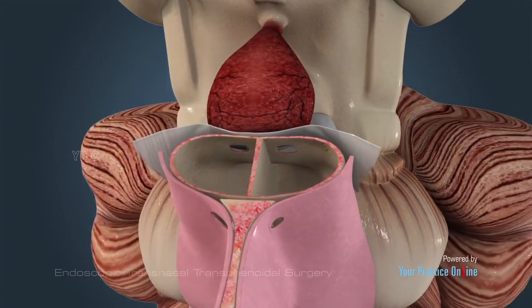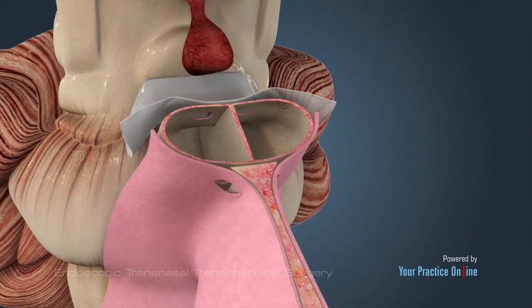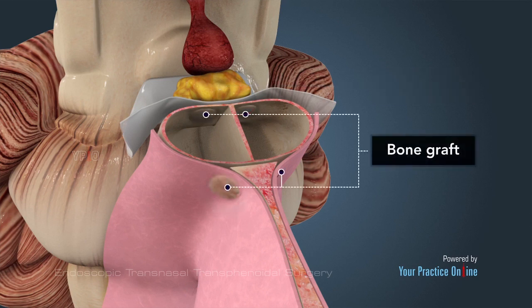Your surgeon uses special instruments called curettes through the other nostril to remove the tumor. At the conclusion of the procedure, your surgeon will usually take a fat graft from your abdomen, which is used to repair the opening into the skull base and to prevent any CSF fluid leakage. Sometimes bone graft may be used to close the opening made in the base of the skull. Your surgeon will apply biologic glue over the graft to promote healing and prevent leakage of cerebrospinal fluid into the nasal cavity.